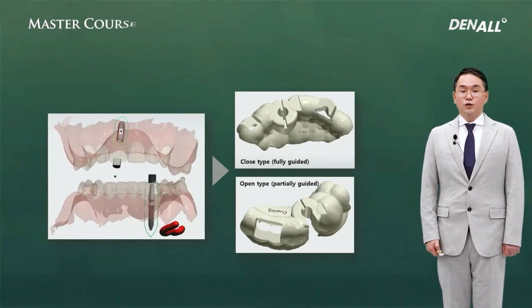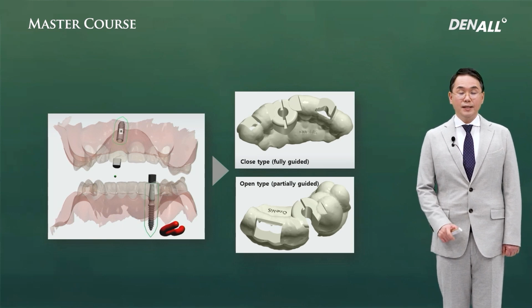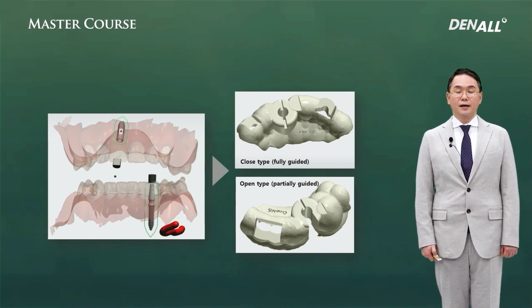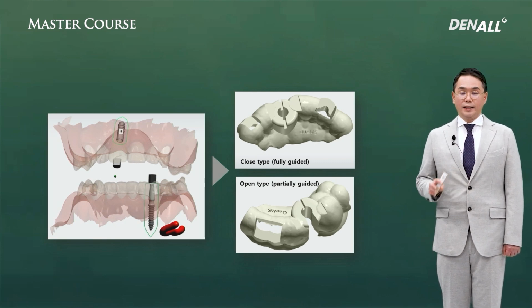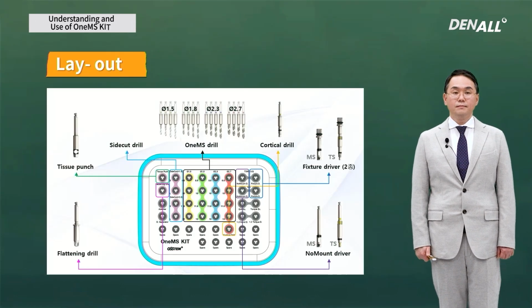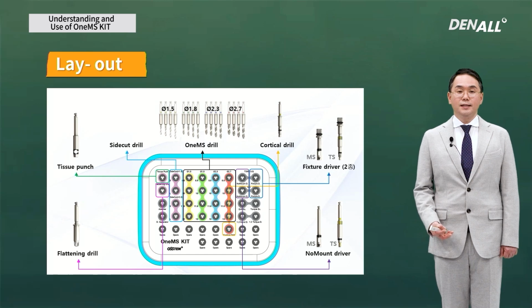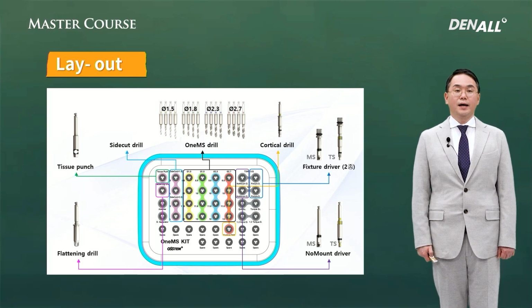In the 3Shape Implant Studio, the OneMS system library is included. If you click on the OneMS system, naturally, the OneMS template is generated. Just like the OneGuide system, there is the closed type and the lateral open type. There are two choices. Through the OneMS template, MS implants or TS3 3.0 can be placed using this OneMS kit.